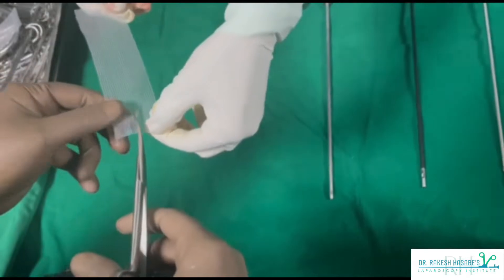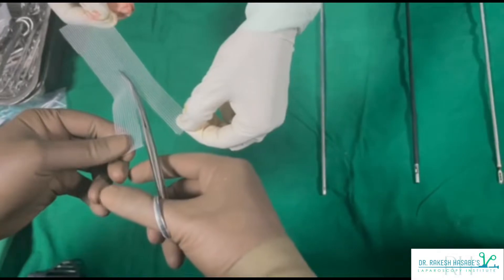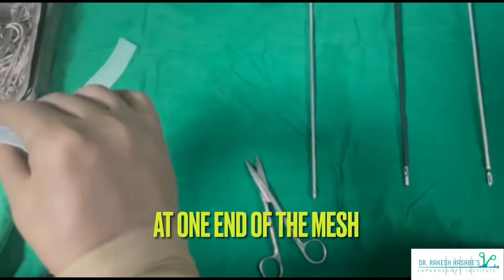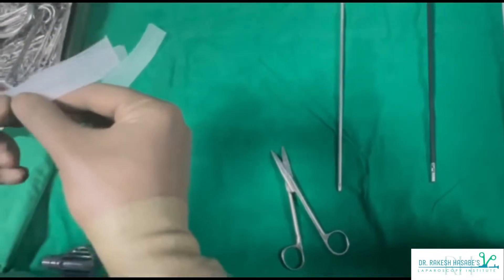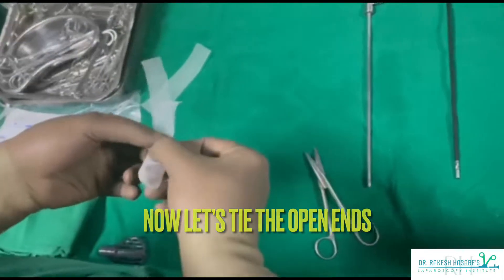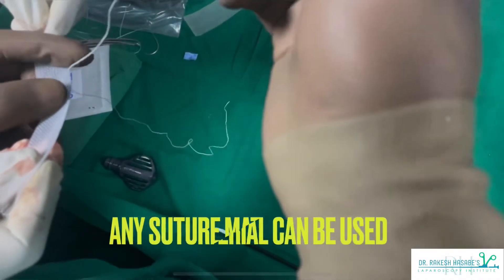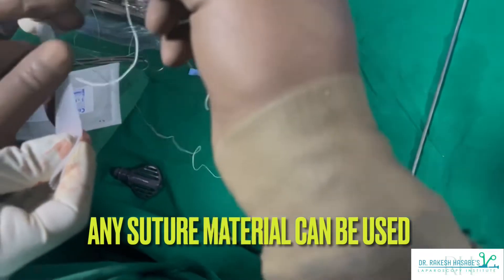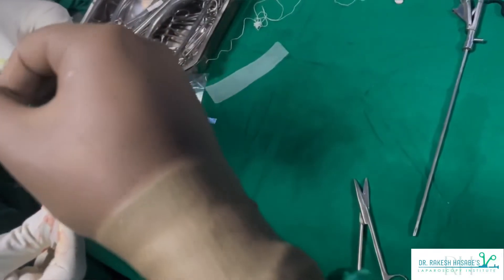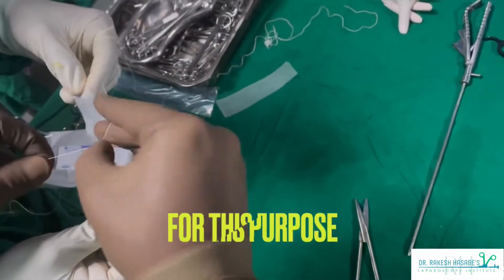As you can see on the screen, I am using routine prolene mesh which we use commonly for hernial repairs. For laparoscopic sacrocolpopexy, I will need a mesh of about five to six centimeters in length and a width of about three centimeters. Accordingly, I have cut the original mesh into a small part having a width of about three centimeters.